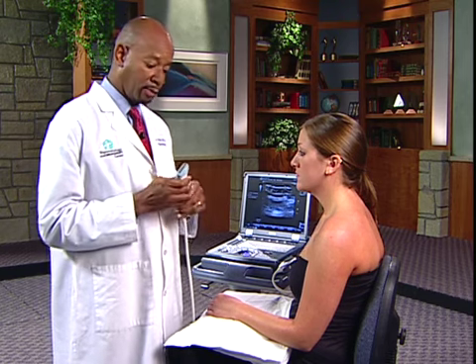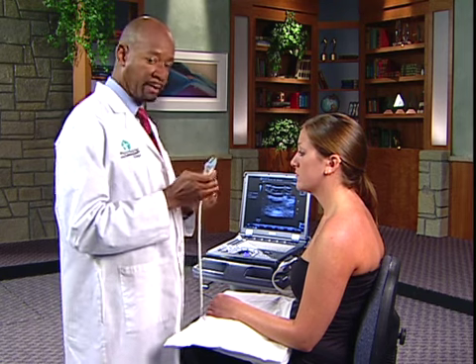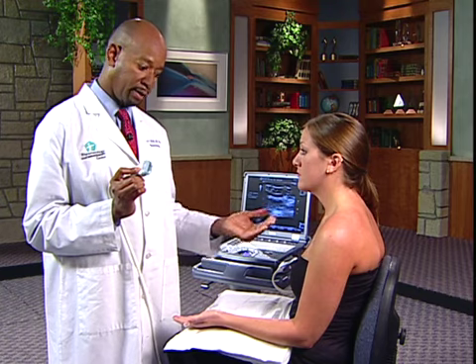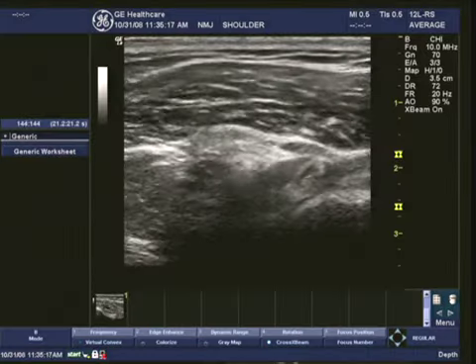With the shoulder exam, we've done a lot of moving around of both the patient and the transducer. It's very critical that you don't lose your orientation. One of the nice things about the Logiq E with the 12L transducer is that you have a groove, and that has been preset so that the groove correlates with the medial aspect of the body. So you always want to make sure you have that orientation. In this case, we're going to have the patient's arm with the elbow flexed 90 degrees, and then we're going to extend it out so that opens up the glenohumeral joint and that glenohumeral complex.